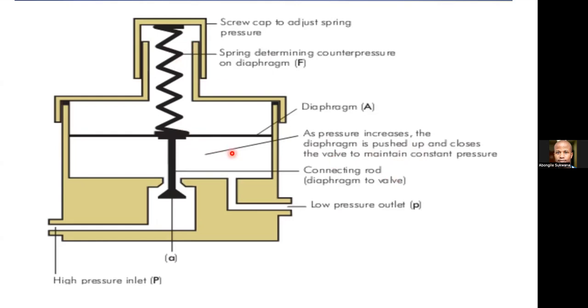It's set such that you get about 4 bar. Because you know how much is coming here, you know how much is coming here, then it will even out or cancel out to provide a certain pressure that you want. In this case, it will be 4 bar. So it comes here as 137.